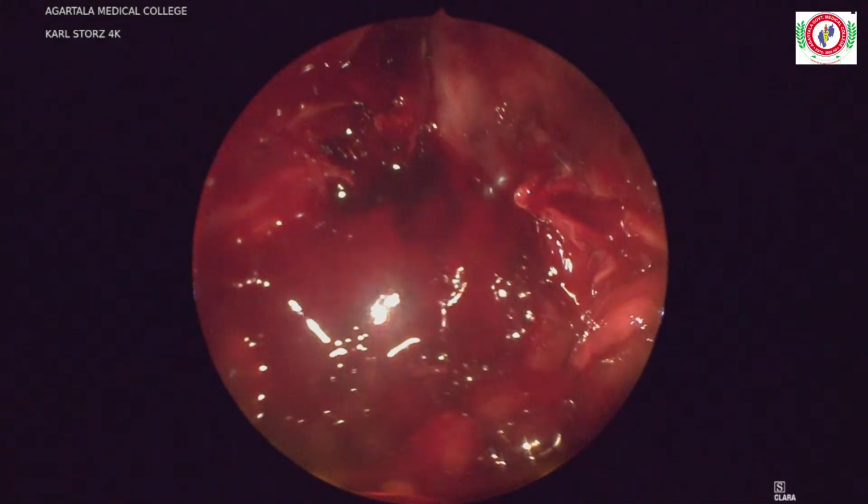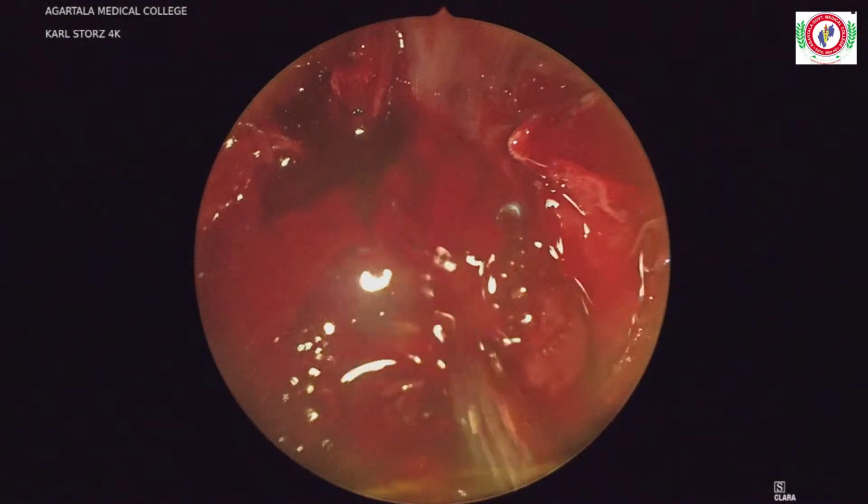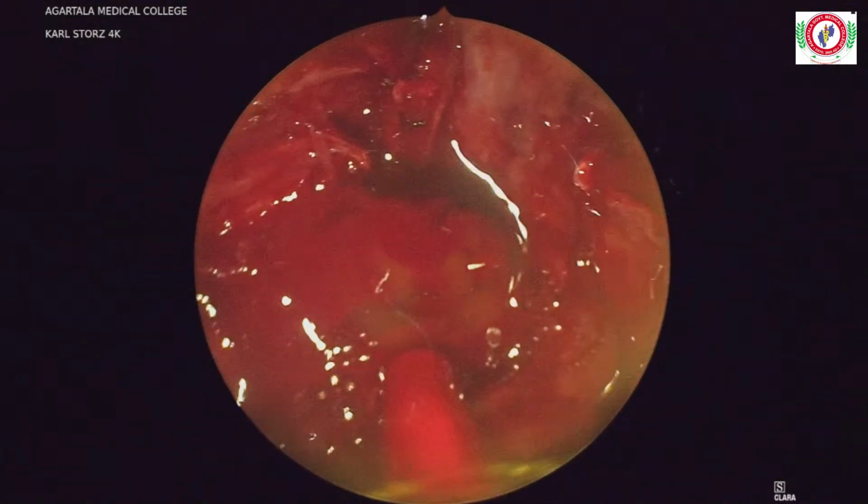Give me suction. Not working. Please. Don't do this here. Suction is not working. Debrider is not working.